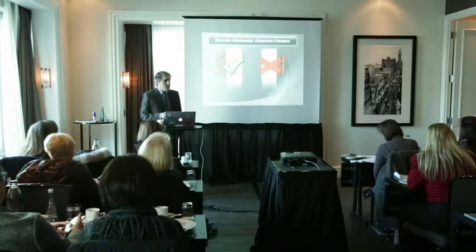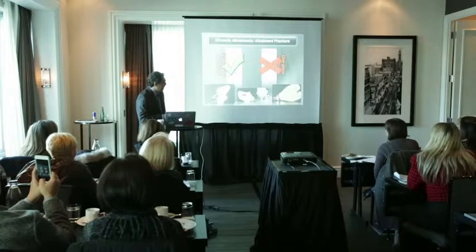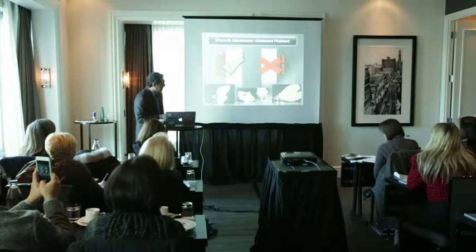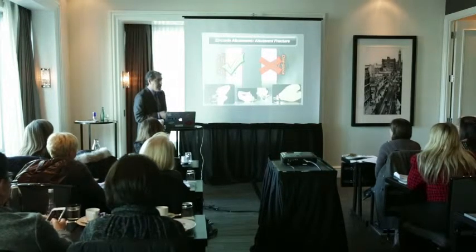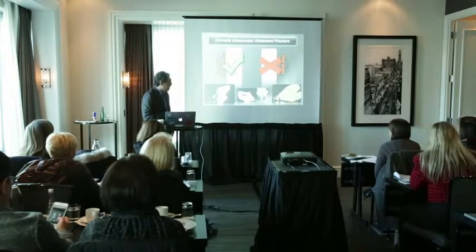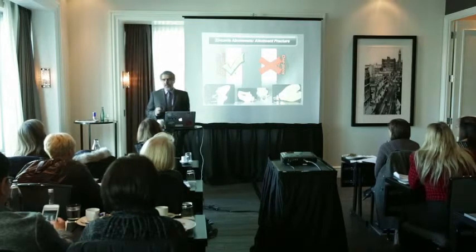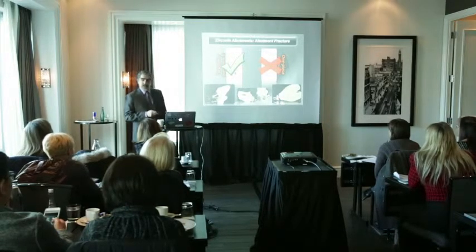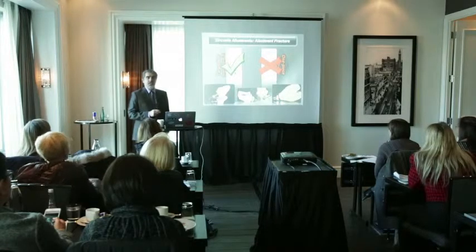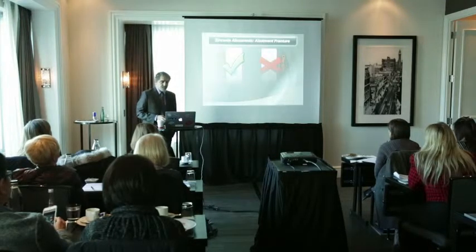It's a known fact, with the one-piece zirconia abutment, you're going to have the connection between the zirconia and the metal. Zirconia is going to be somehow abraded, and then you're going to have the fracture just like that. So extremely important. Make sure that your technician is going to use the two-piece zirconia abutment instead of one.